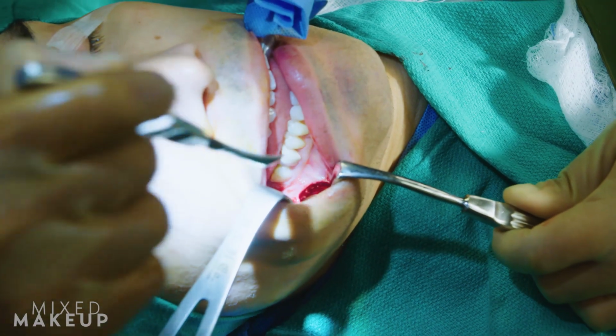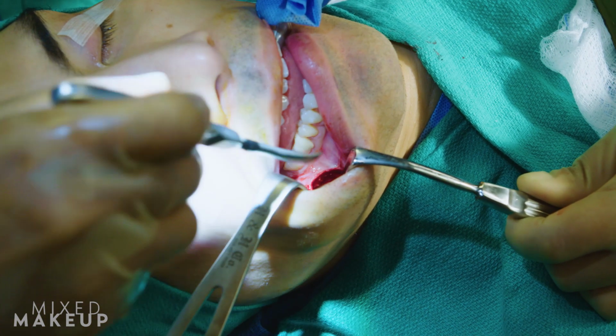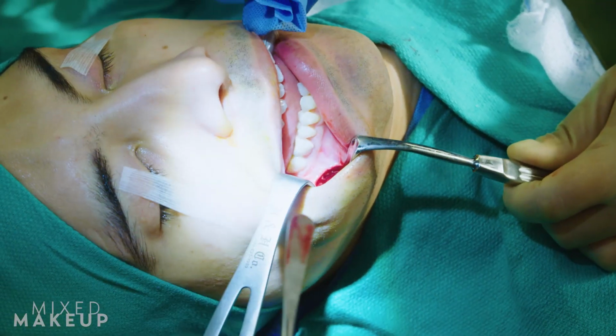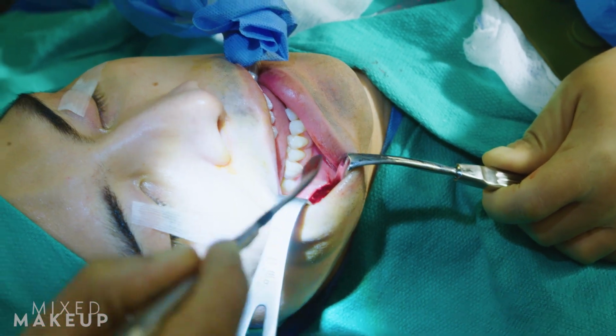Okay, so this is a shot through the mouth. Small incision, it looks stretched, but it's actually just a small incision the size of a nail bed. It stretches so nicely that I can make the incision very small and then get access to everything. And this connects all the way to the chin incision. As you can see, it's very dry. There's no blood. It looks healthy. It's gonna close beautifully. So I'm gonna show you now how we insert the implant.